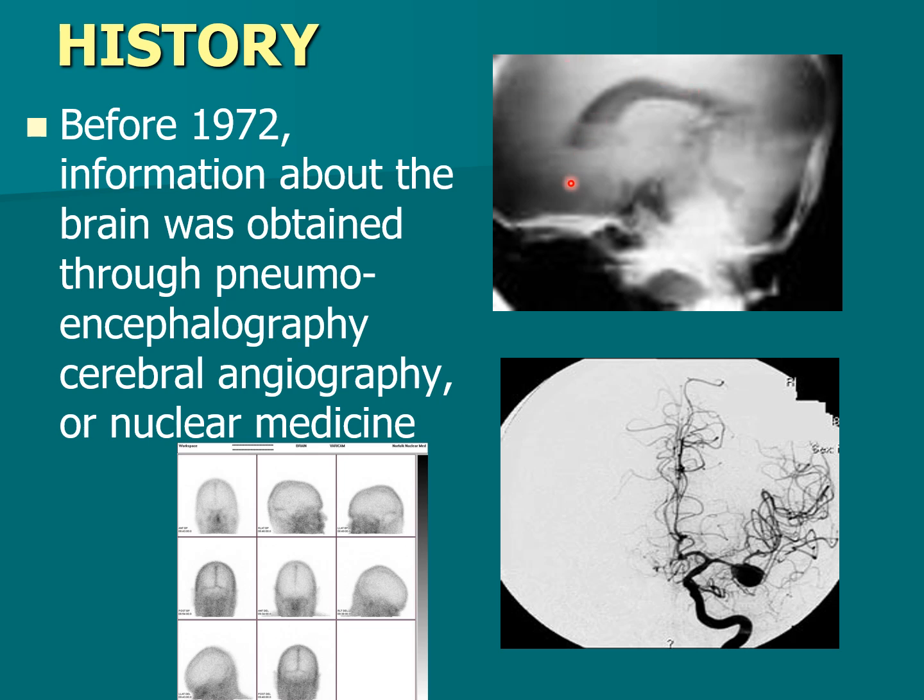It did not tell you anything about the soft tissue, but if you had a tumor here that was pressing on this ventricle, or if this ventricle was greatly expanded because of hydrocephalus, then you could have seen that something was going on. Very rudimentary, but you had some view.